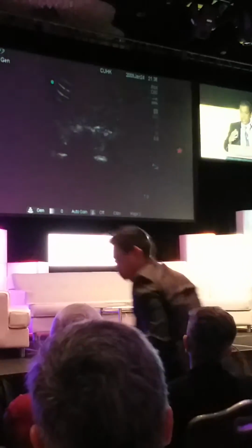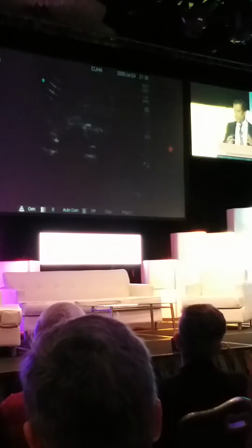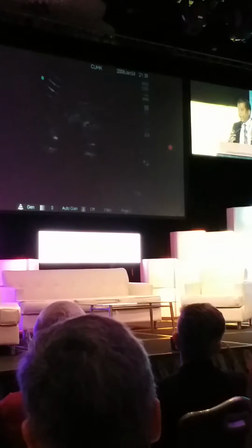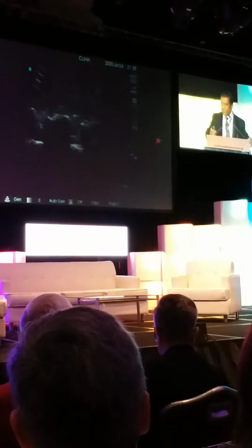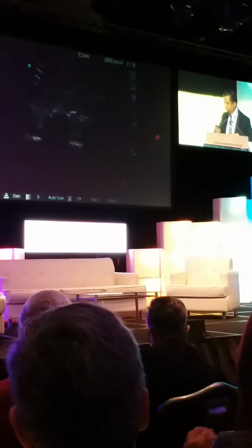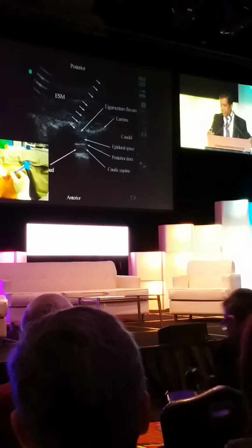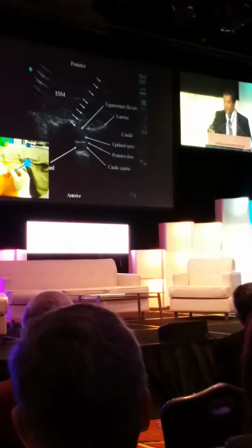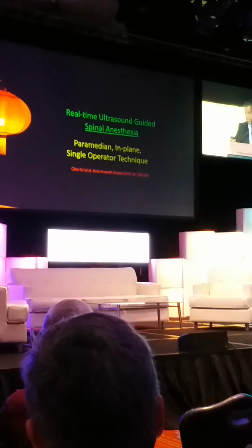These are morphological changes that occur within the neuraxis. Now you can imagine, ladies and gentlemen, why dry taps are not uncommon when you do a needle-through-needle CSE. Maybe the thecal sac is compressed in the area that you have done. This is for a discussion another day. Nevertheless, widening of the epidural space and compression of the thecal sac is a consistent finding we found in about 50% of our patients that we had studied during this time.